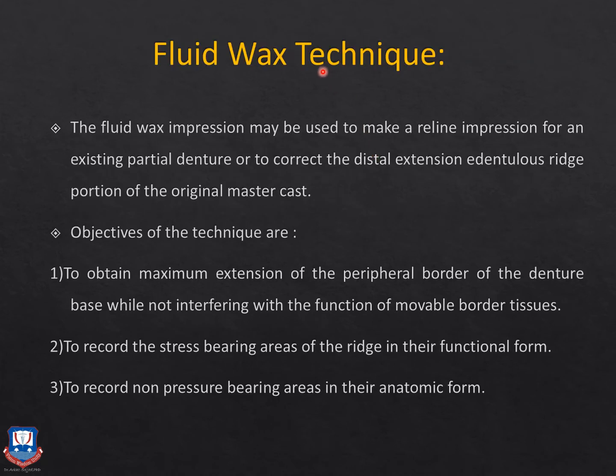And then the fourth technique is the fluid wax impression technique. This is different from the functional relining technique in that the fluid wax impression technique is done at the cast framework fit-in appointment, that is, before the jaw relation, before the teeth setting or teeth trying, or before the denture insertion.